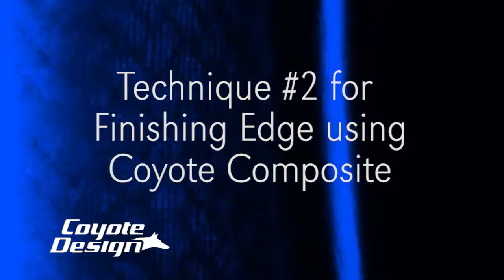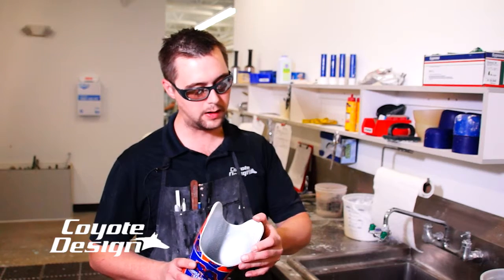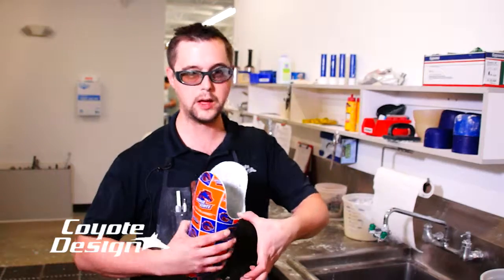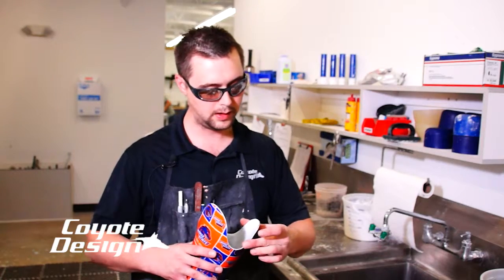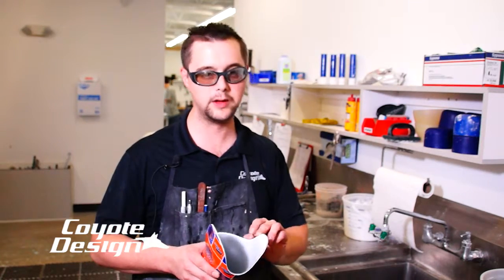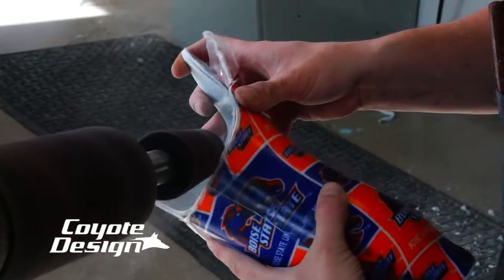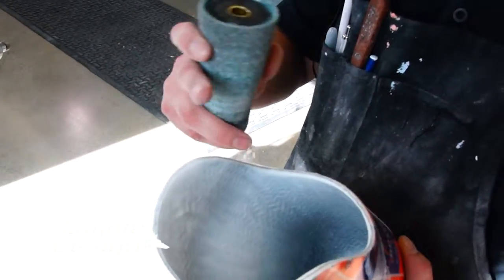We have one other little technique that Brad likes to use. One of the concerns with laminating Coyote composites is the finished edge that you get — this will leave a nice smooth finish. I use the rough cone, the roughest cone you can do, and go ahead and take that down to your trim lines.